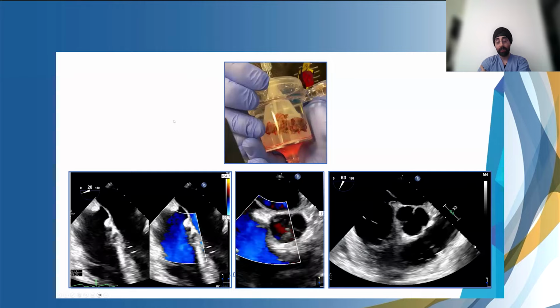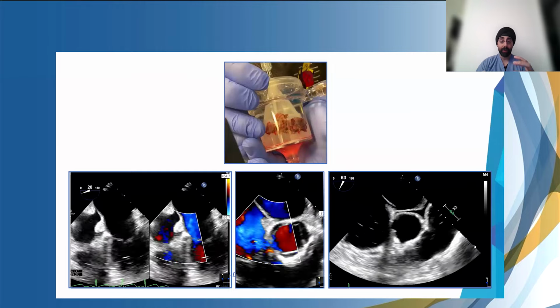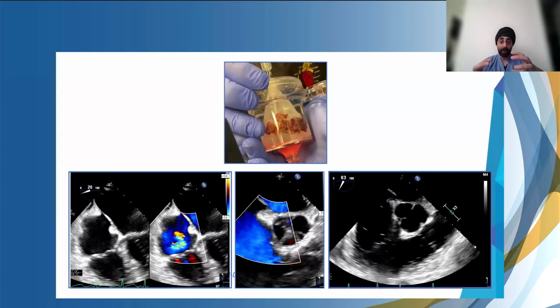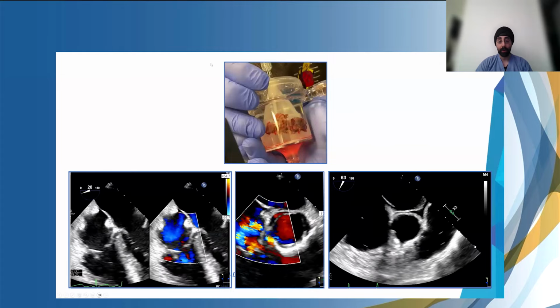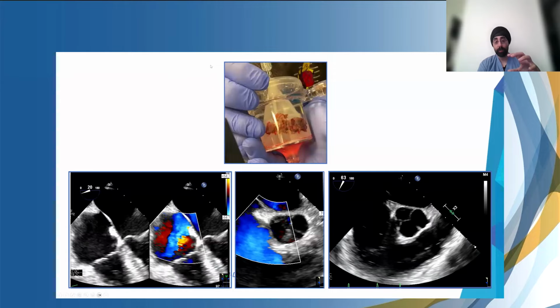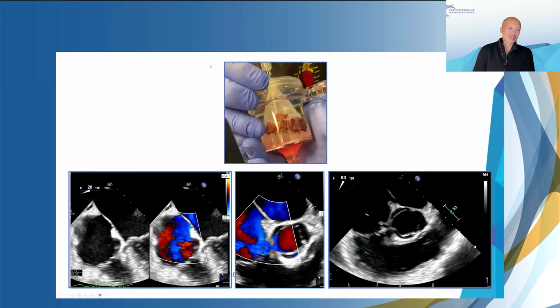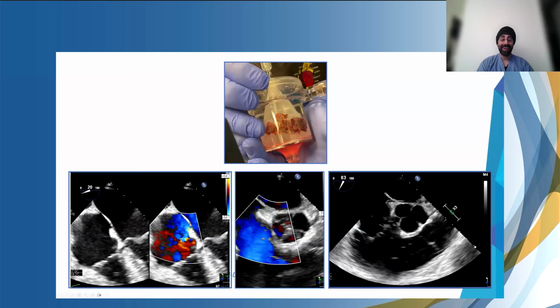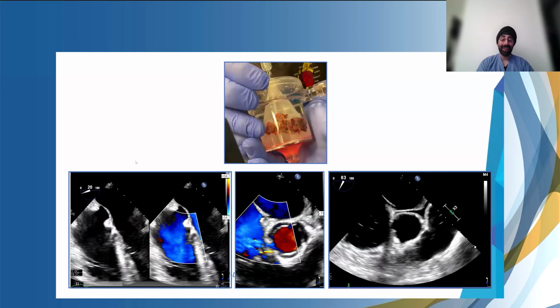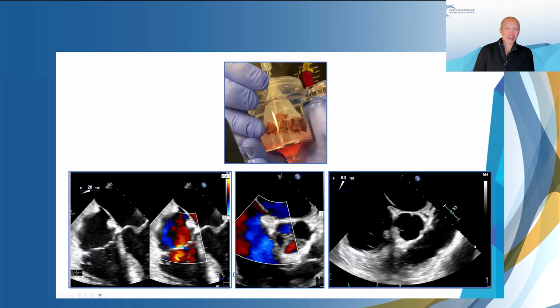I think though what happens as it's moving around, you create that sort of whirlpool effect, and that stabilizes it a little bit, like an attraction almost. I don't know if you felt that. When the catheter gets close, you turn up the flows, and it just sucks into it. Yeah, there's a lot of excitement and it starts chugging. I tell my fellows, you feel that? And it's amazing how this picture at the top looks like my Dyson vacuum cleaner.